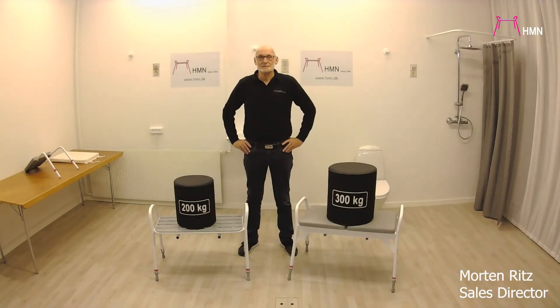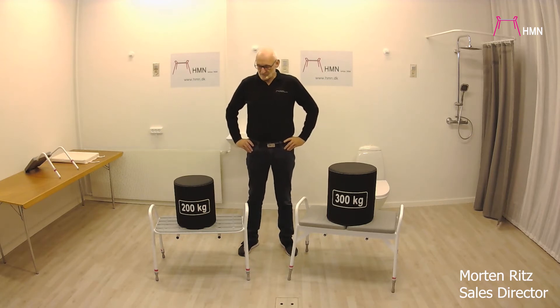Welcome, my name is Morten from HMN. This video will be about the two bariatric shower stools we have in our assortment.